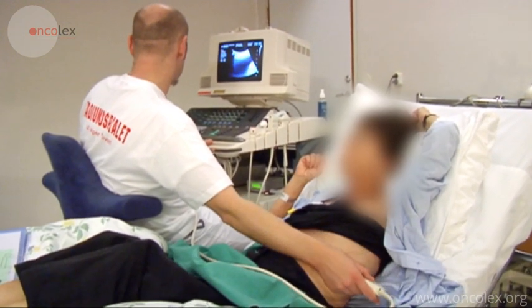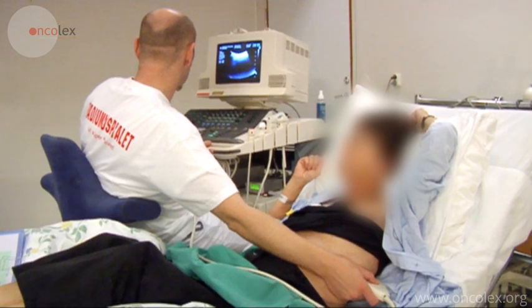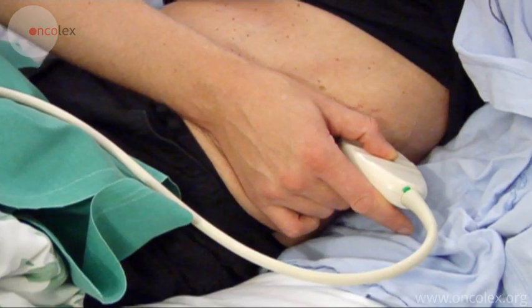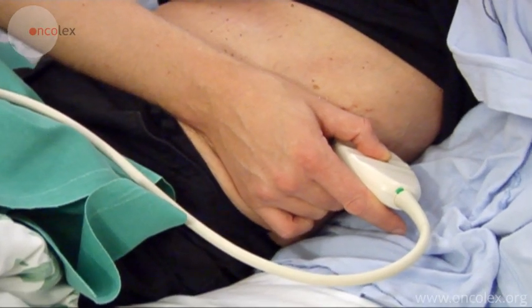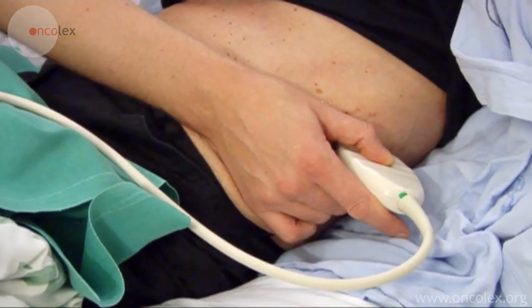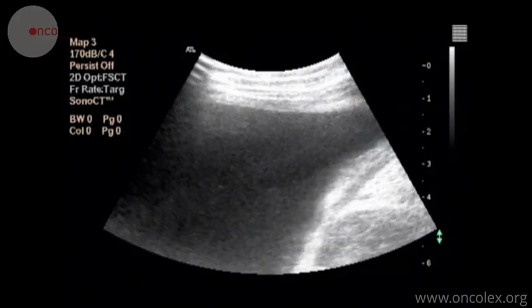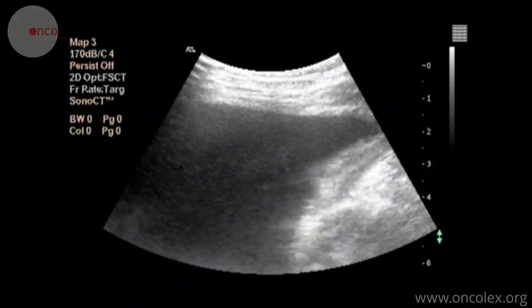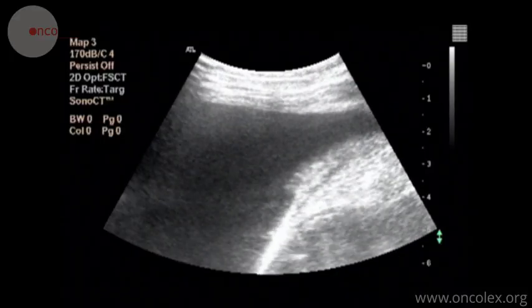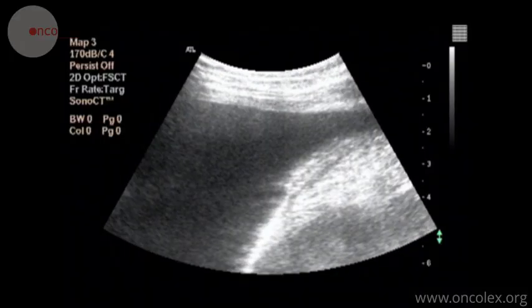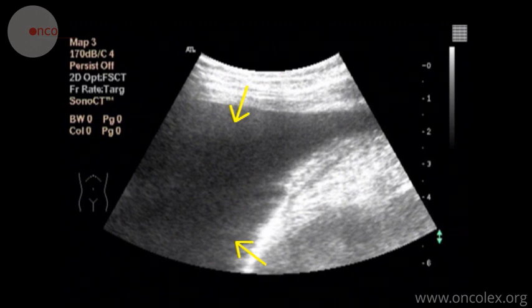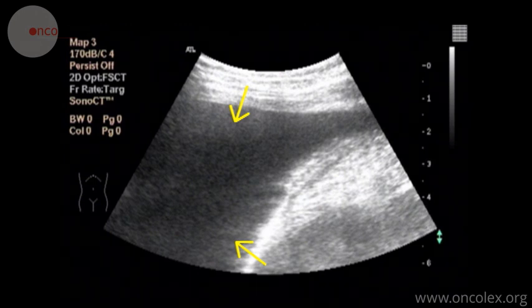The patient is examined with ultrasound and the puncture site is chosen. The puncture is made at the point of optimal access to the fluid. This is the fluid accumulation in the pleural space.